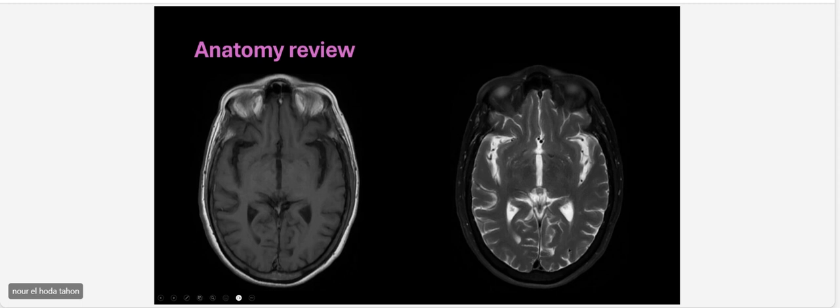Okay, so this is the end of the occipital lobe, and after that, in the next cut, we start to have the parietal lobe. And here is a part of the occipital horn of the lateral ventricle. Again, make sure you know it very well, how it looks, because when I show you some lesions, you can imagine the mass effect and how it looks.